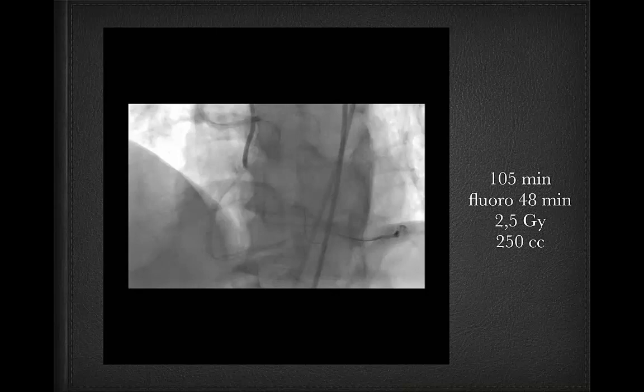No, it depends. If there is a tapered proximal cap, I can go directly with a soft wire. But if it's a blunt stump or I feel that I need some puncturing, yes, it's my work.